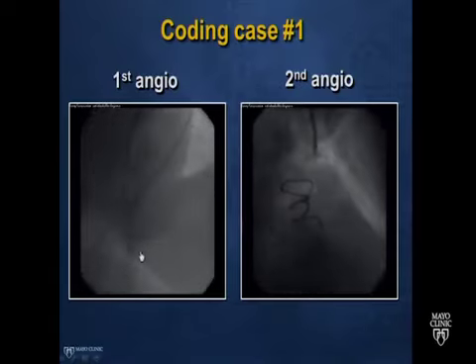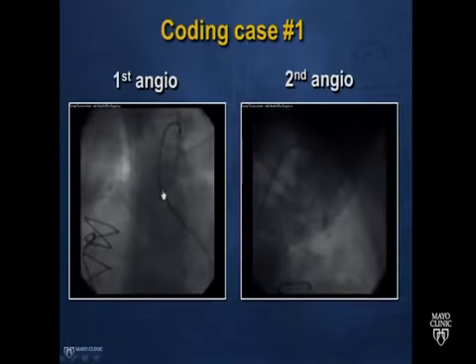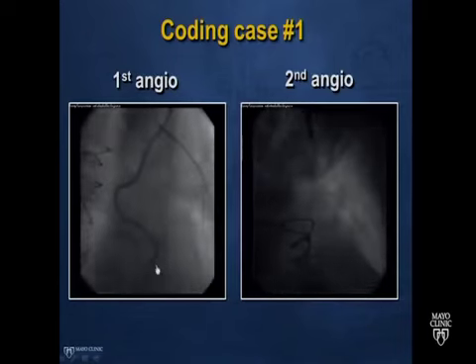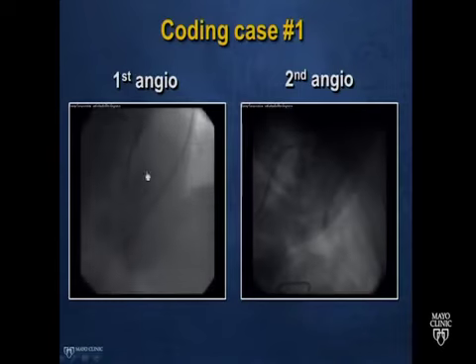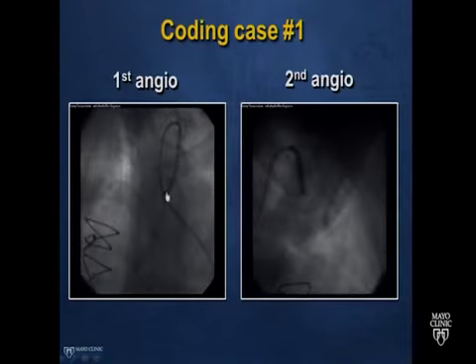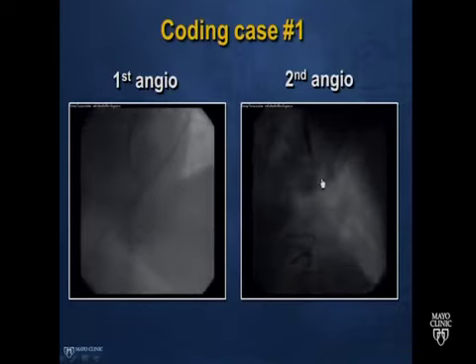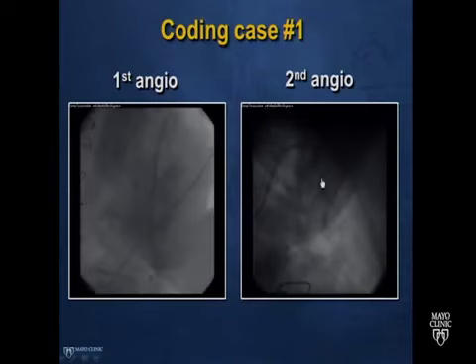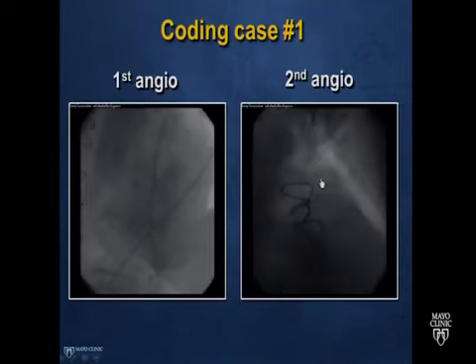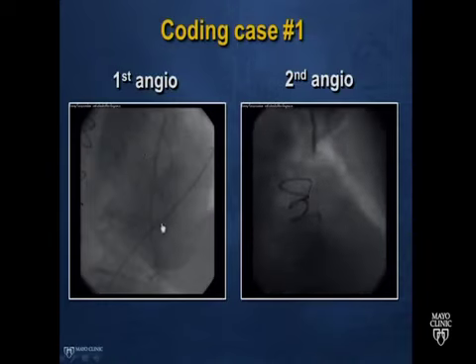And if you wanted to code severe stenosis of the LAD, you would be correct here as well, because there's retrograde filling, but it does not fill up much of the vessel, and we would also suspect the graft is put in there because of stenosis. In this view here, this is a view taken after this view, and here we have a dissection of the LIMA artery. So this is a dissection of the LIMA graft as well as the other elements that we would code.